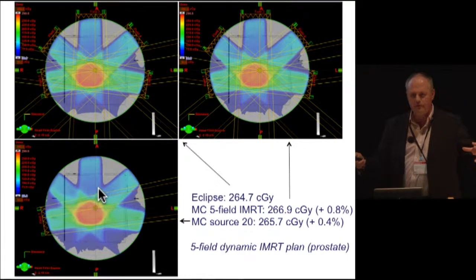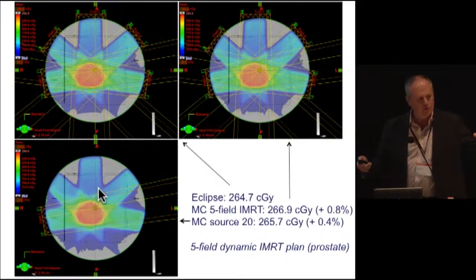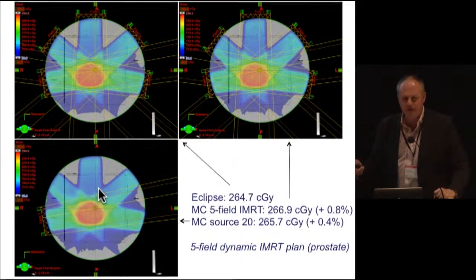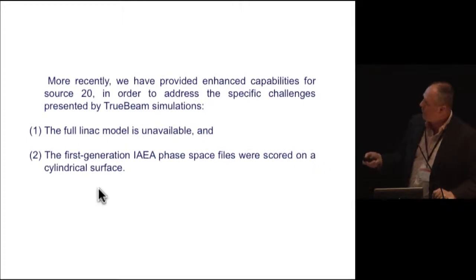transforms again the raw 3D dose into an absolute dose, and embeds that into another DICOM file, which can be brought back into Eclipse for the purpose of side-by-side comparison, or taking advantage of all the tools available there, such as dose volume histograms, plan subtractions, and so on.